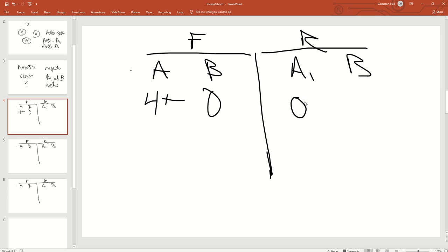So we would expect no reaction here, but what about B? Would we expect their serum to have anti-B in it? We would. If they're a type A cell, we would expect anti-B to be in their serum. And so in the reverse, we have control B cells with B antigen on them. So we would expect the anti-B in the A person's serum to react with this. So we should have 4+ over here in B.